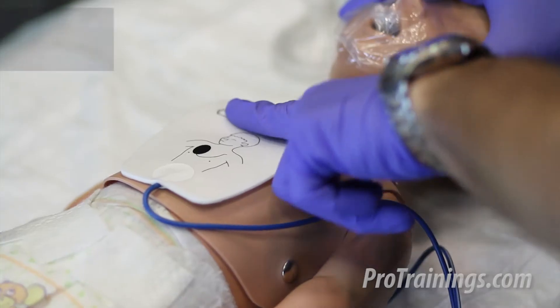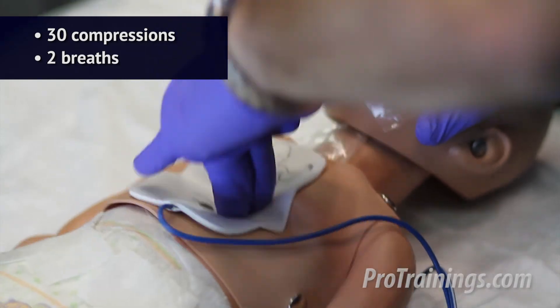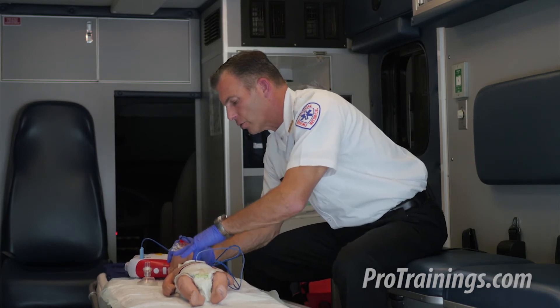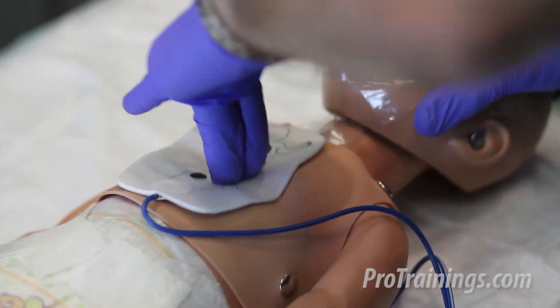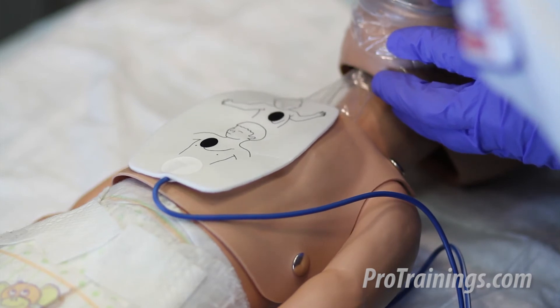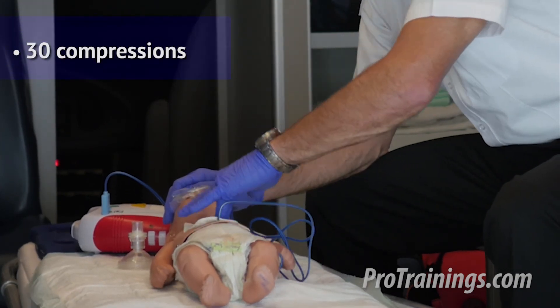Shock delivered. Begin five cycles of CPR. I go into my 30 compressions followed by two rescue breaths, counting: 8, 9, 10, 11, 12, 14, 15, 16, 17, 18, 19, 20, 21, 22, 23, 24, 25, 26, 27, 28, 29, 30. I perform compressions right over the AED pads — I will not remove the AED pads.